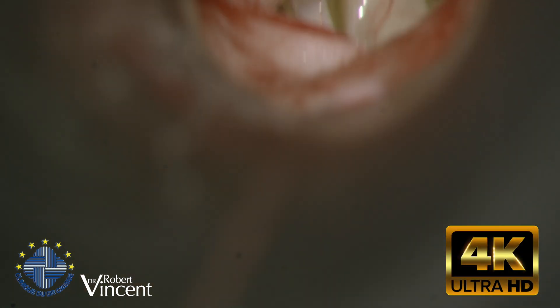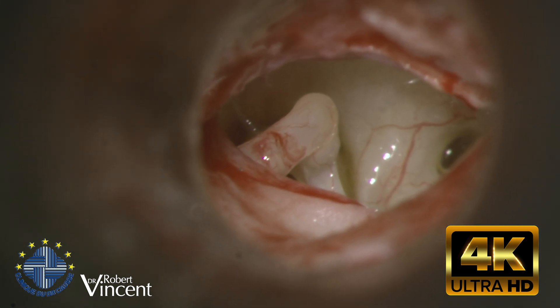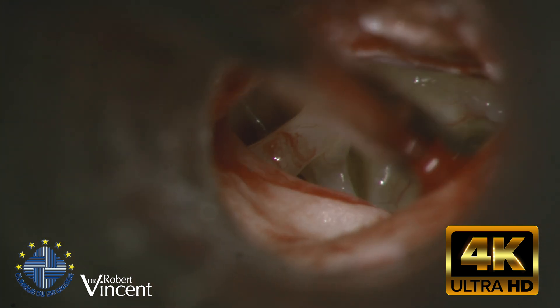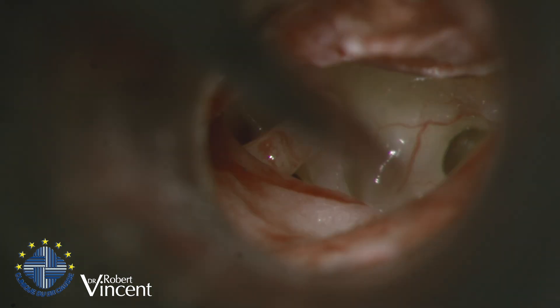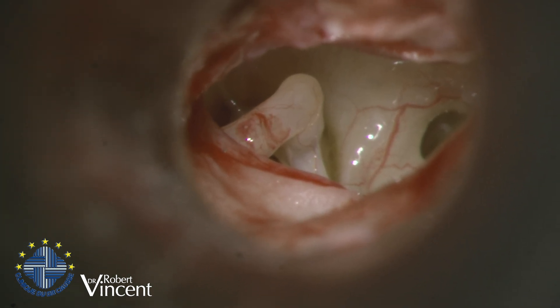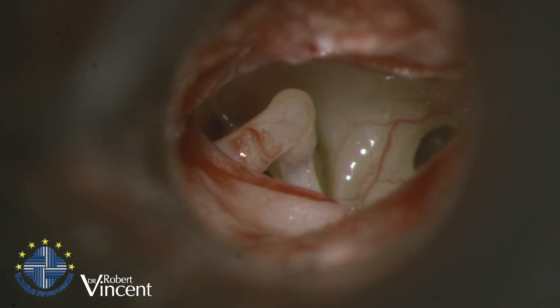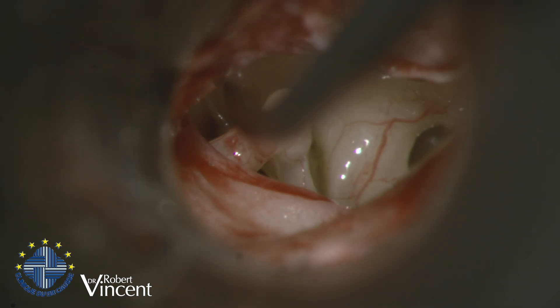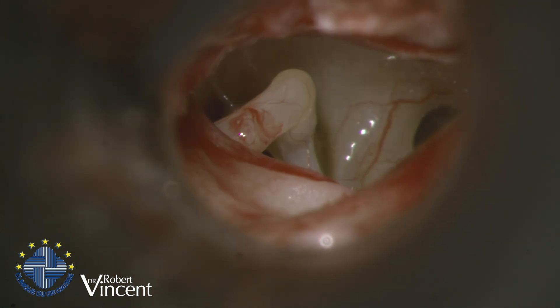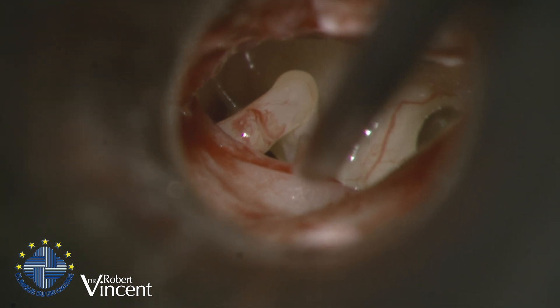This is a right primary surgery for otosclerosis. Since I haven't been uploading videos on primary stapes surgery for a long time, I think it would be interesting to show you again this technique. This is the transcanal approach — here we can see 12 o'clock, 3 o'clock, 6 and 9 o'clock. I have already elevated the tympanomeatal flap following a skin incision running from 6 o'clock to 12 o'clock, and we are now facing the incus, the incudostapedial joint, and the stapes.